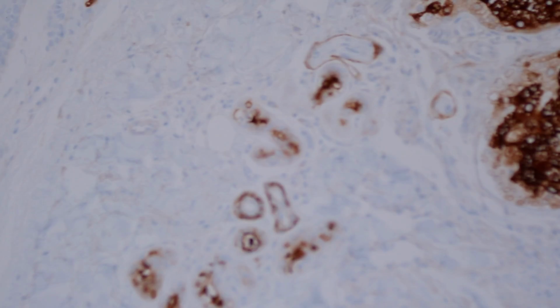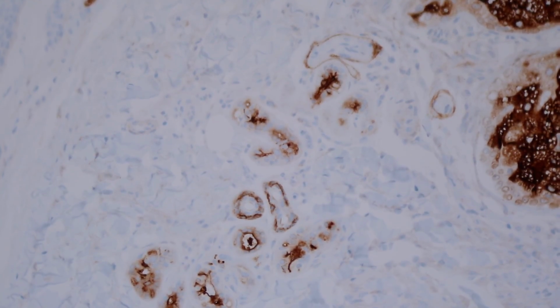Now, here's the other thing that EMA is cool at doing, and it will highlight parts of the eccrine glands and ducts. And here in the glandular portion of the eccrine coil, the secretory portion, you can see that the EMA is highlighting not all of the cells, but it's actually really highlighting that membrane that lines the inner lumen of the duct, that the apical surface of the secretory cells are really strongly highlighted.